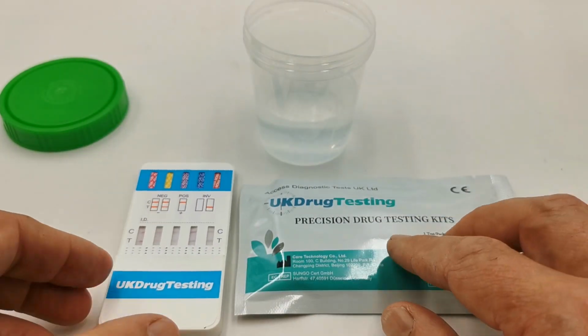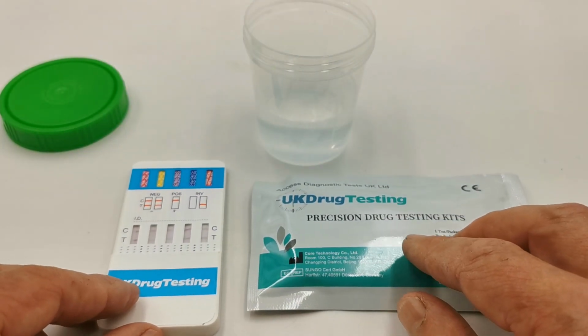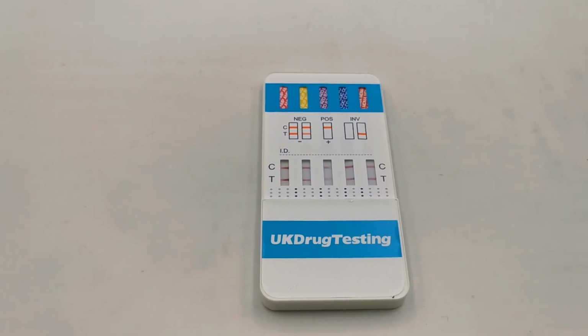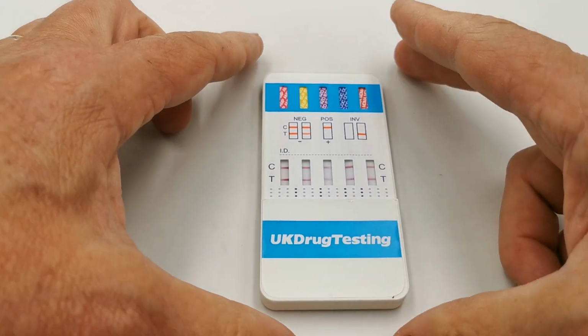You now need to start a timer and come back. We recommend you start your timer for 5 minutes and interpret the results showing at that time. So we'll do that and show you the test results from this panel. Well, my 5-minute timer has just gone and we're going to show you the results now.